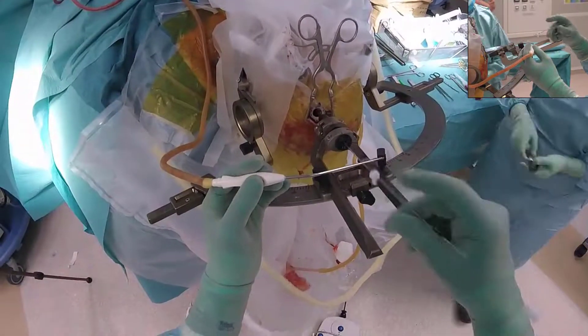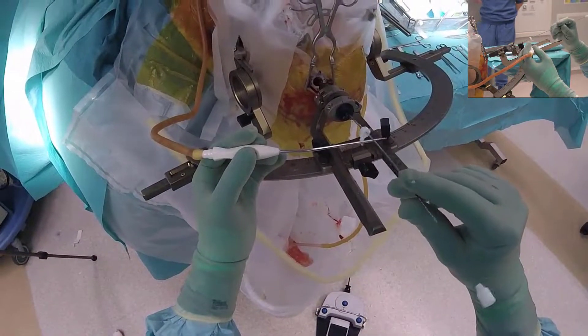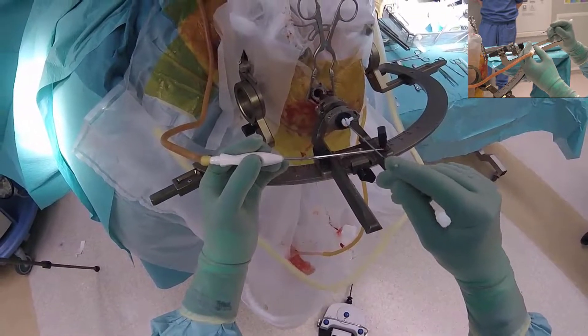When implanting the electrode in this manner, the dura will typically not be opened for more than two minutes before the electrode is implanted and the opening closed with tissue glue.